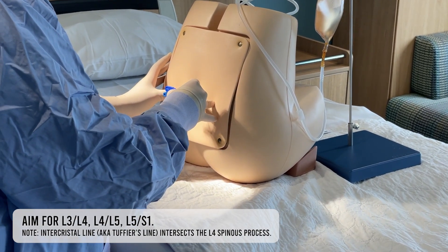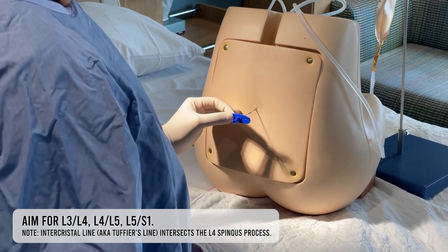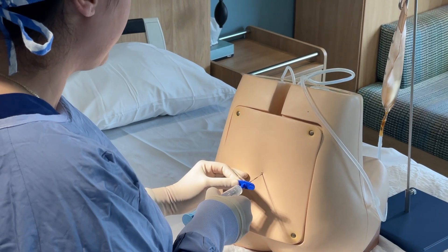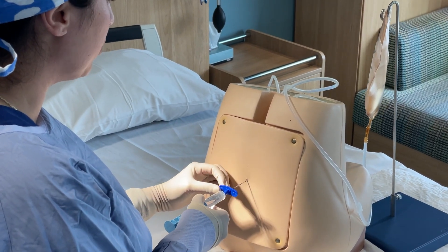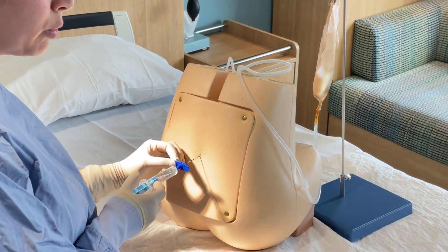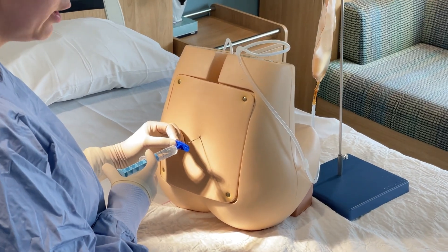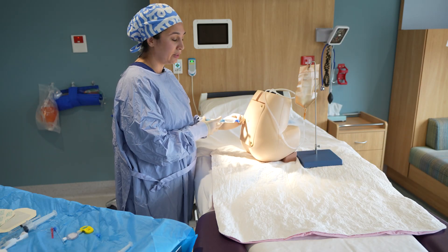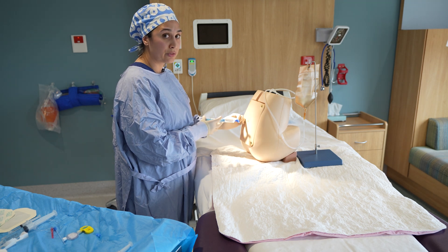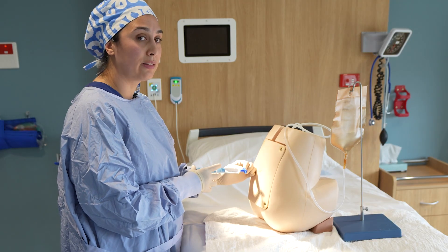Once you've found your space, pop in your Tuohy needle and wait until you get a grippy sensation, which indicates it's in the ligament. Before proceeding, it's really important to place your left hand against the patient as a brake or brace and provide continuous pressure on the plunger. The left hand is also moving the needle while providing counter-traction to avoid going too far or jumping.